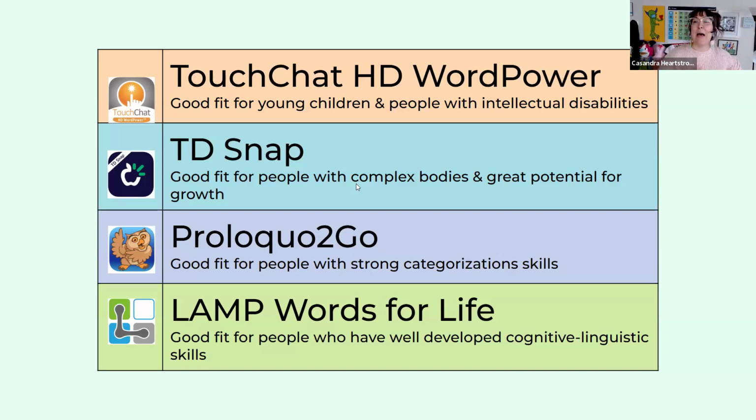Tobii Dynavox does an amazing job at connecting with different access interfaces. They've got great eye gaze technology. They have great switch scanning technology. And also TD Snap has great potential for long-term use.